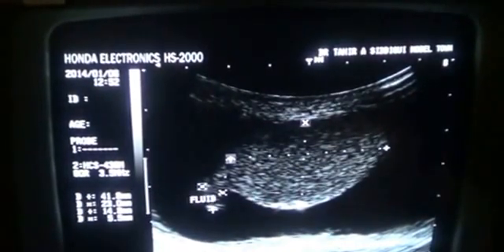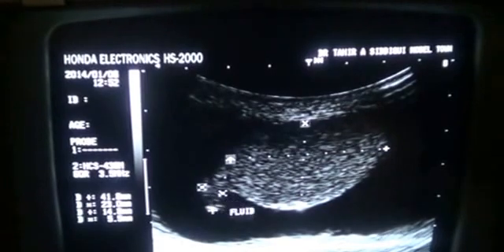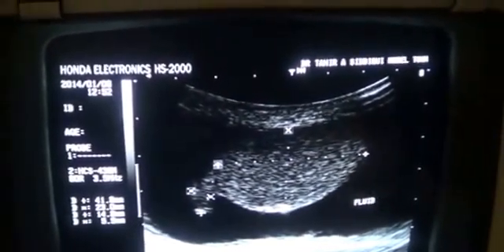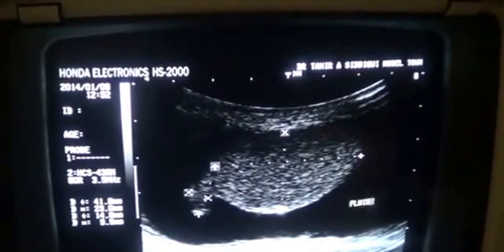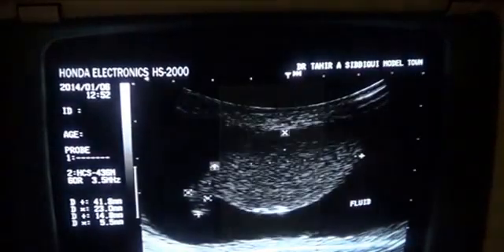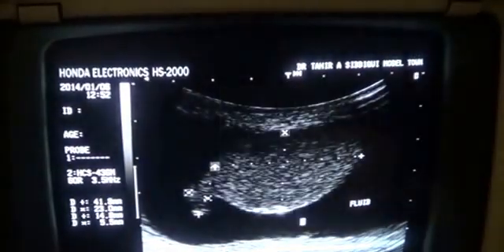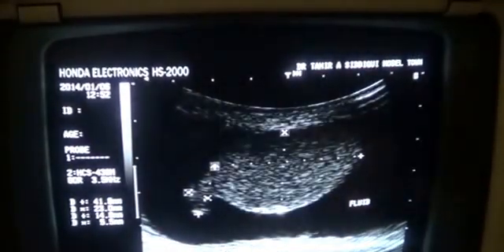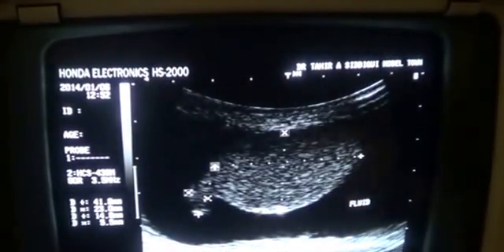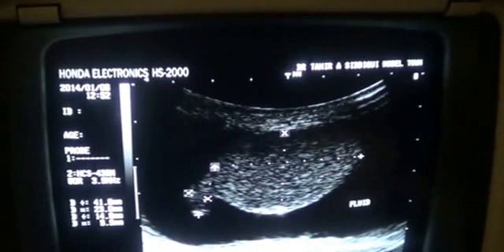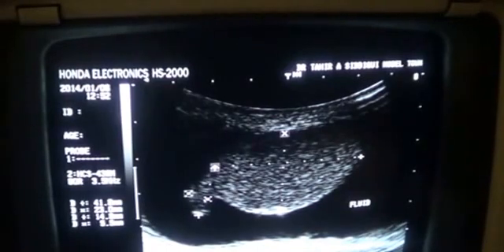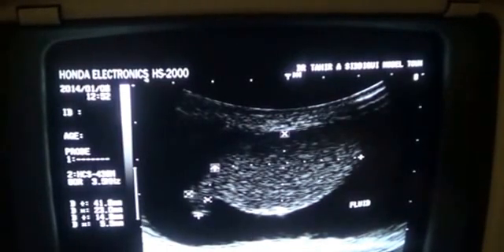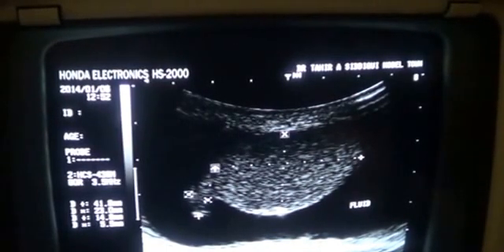This black area is the fluid, and this is the scrotal wall. The wall is not thick.